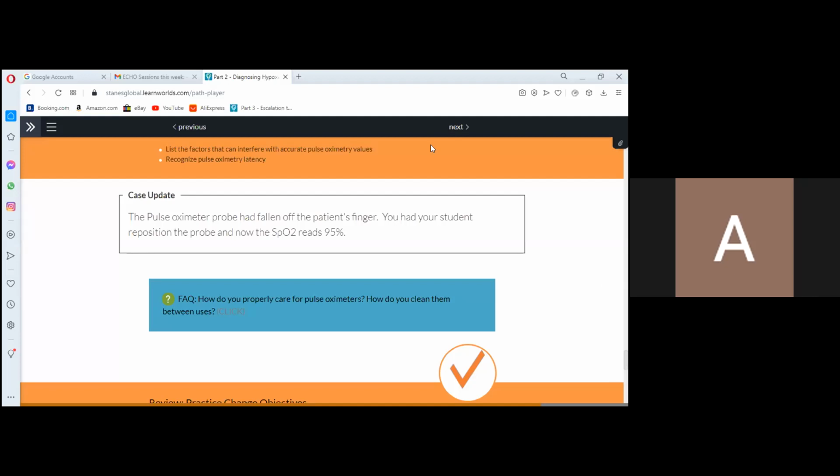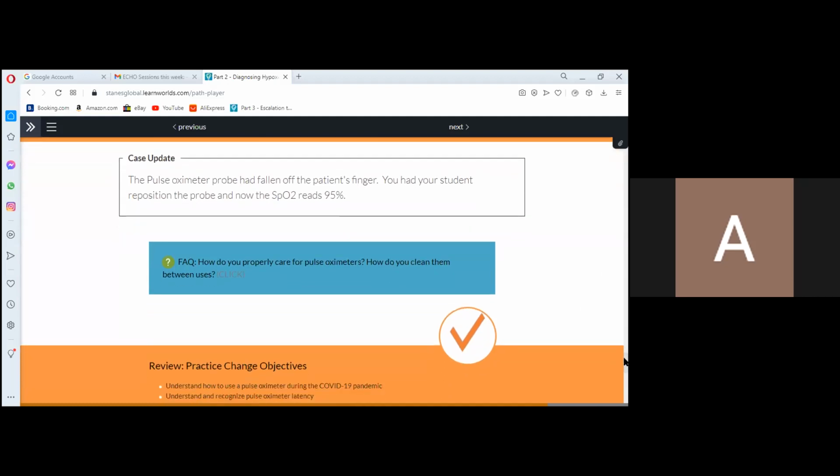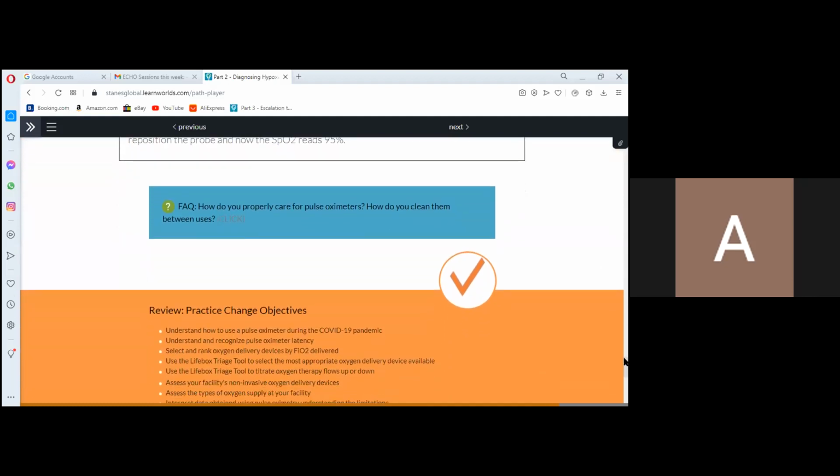Yeah, thank you very much, Suleiman, for this valuable input. We're approaching the time; it is almost 90 minutes since we started. One thing I want to add is that the cables, don't squeeze them after use. You should try to, in a circular fashion, roll them and keep them safe, so that you can prolong the use and the function of your equipment.